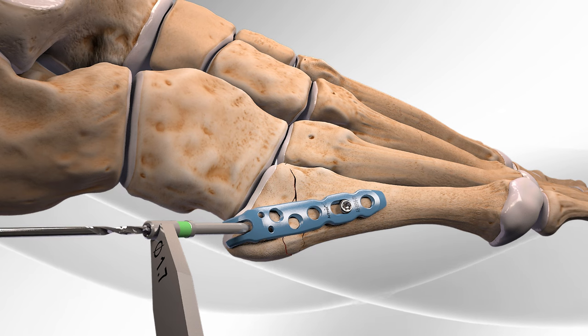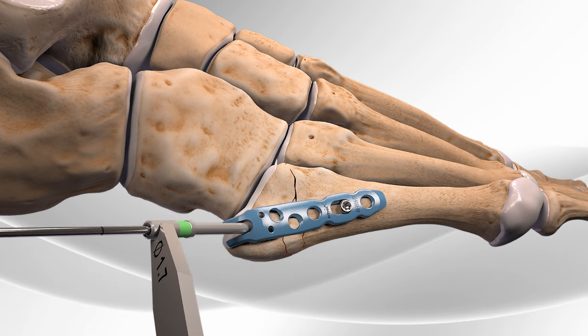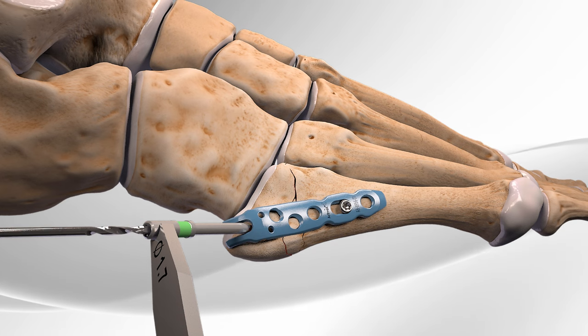The surgeon drills another hole at the base of the plate and uses a handheld measuring device to determine the length of the second screw.